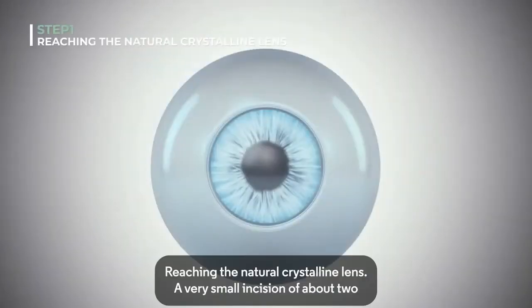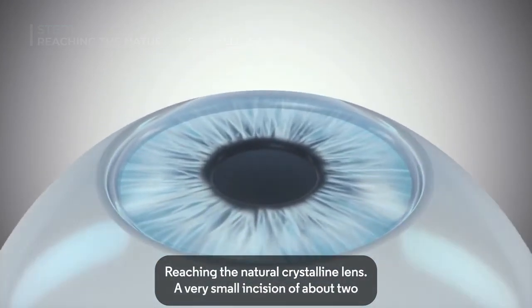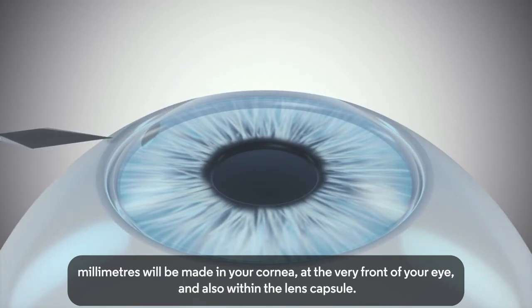Your surgery will be complete in three steps. Step 1: Reaching the Natural Crystalline Lens. A very small incision of about 2mm will be made in your cornea, at the very front of your eye, and also within the lens capsule.